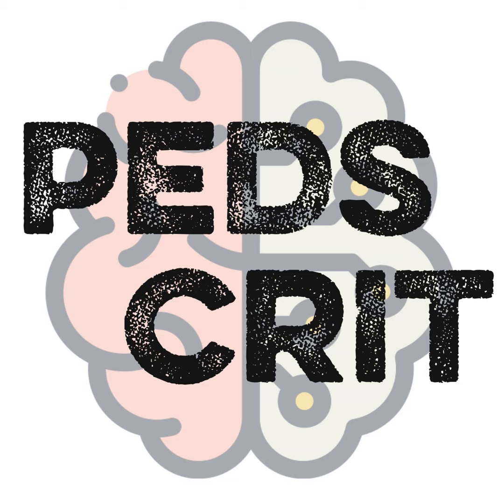And one thing that we didn't mention is that there's 2 types of tests when we're thinking about ECMO anticoagulation. We have our whole blood tests, and then we have our plasma-based tests. So ACT is a whole blood test versus PTT, which is a plasma-based test, as technically you would think about anti-10A as well. Our other whole blood tests would be our viscoelastic assays like TEG or ROTEM. And so these are kind of the new cool testing on the market for ECMO anticoagulation. And the reason for that is TEGs or ROTEMs give you what we think is a complete picture of a clot.